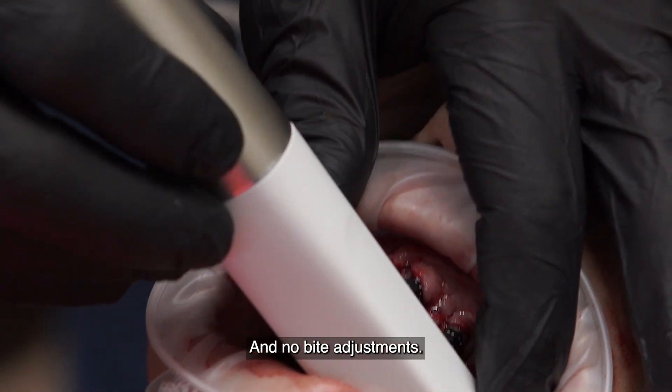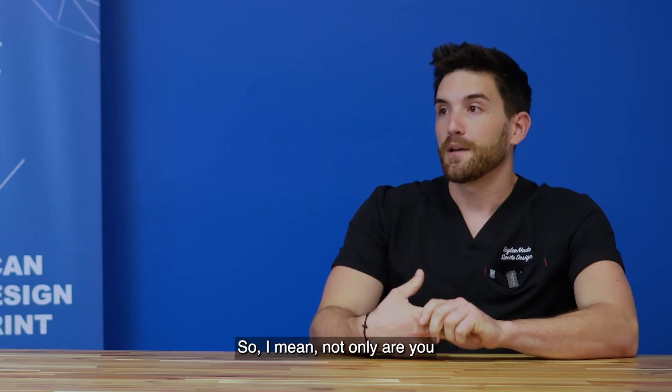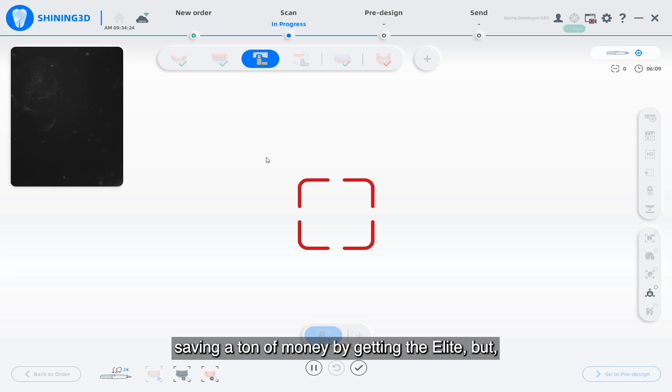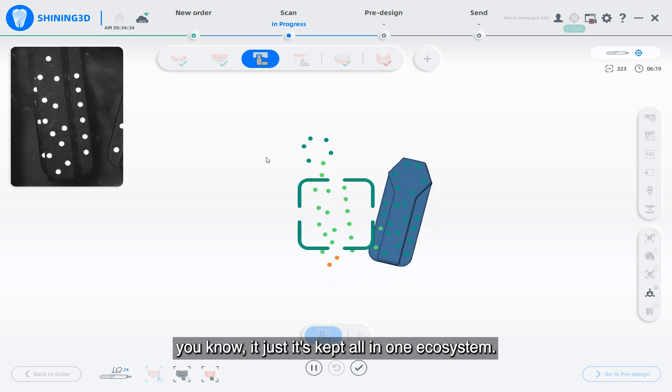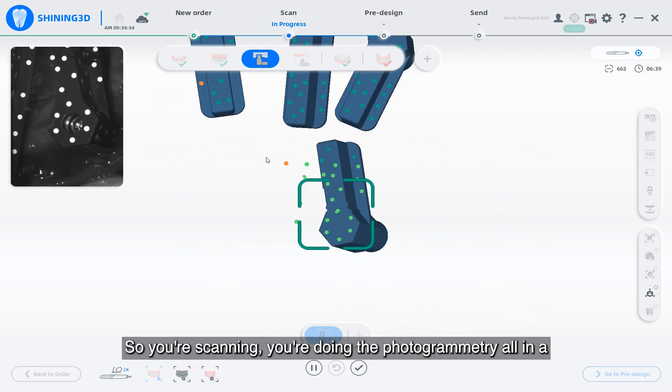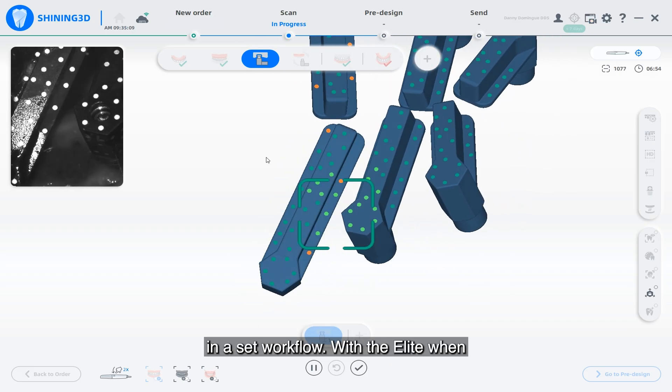Every single case I've done has fit perfectly with no bite adjustments. Not only are you saving a ton of money by getting the Elite, but it's kept all in one ecosystem — you're scanning, you're doing the photogrammetry all in a set workflow.